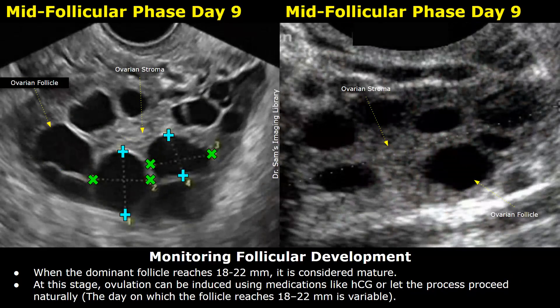When the size of the dominant follicle reaches 18 to 22 millimeters, it is considered a mature follicle. This is the time when ovulation can be induced using medicines or may occur naturally. These images are obtained on day nine — in the left image and the right image, the dominant follicle is visible and its size is increasing.